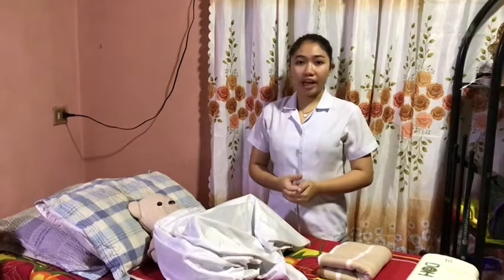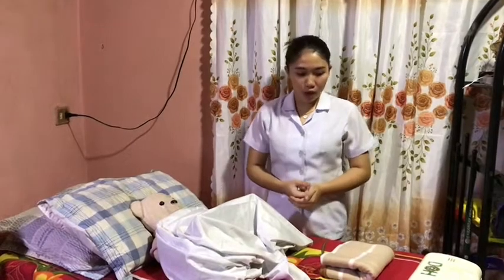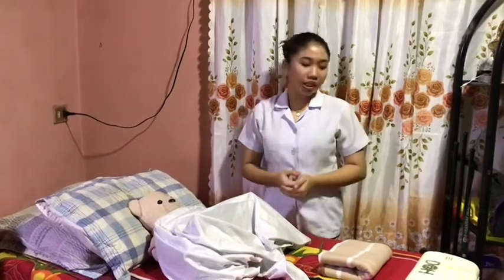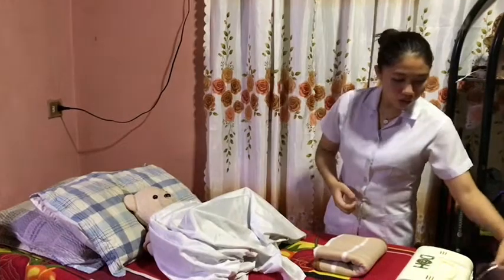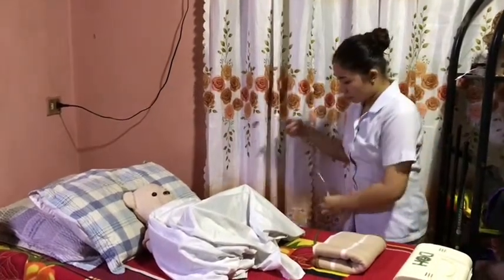Okay. Now, position the patient in a dorsal recumbent position with the knees flexed. This is done to provide good visualization of the meatus where the catheter will be introduced, and also the gravity will aid the flow of the urine when the bladder is higher than the end of the catheter. Now, I'm going to secure the urine bag under the bed frame of the patient.